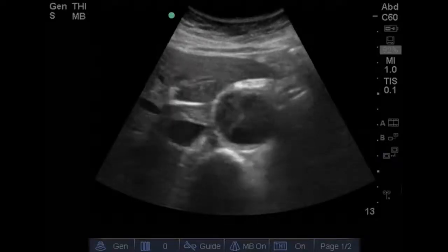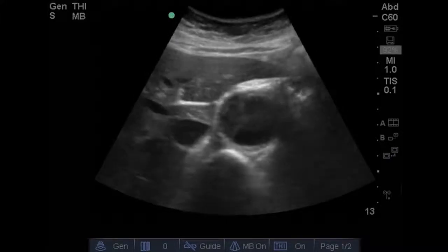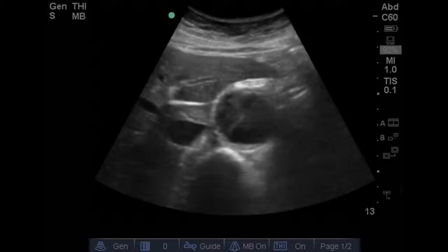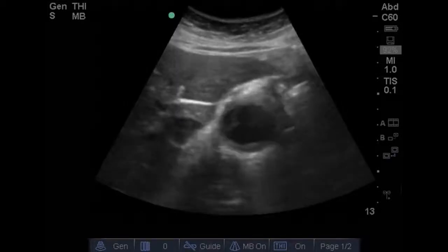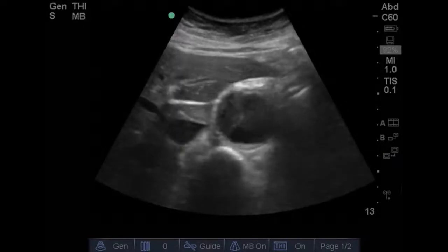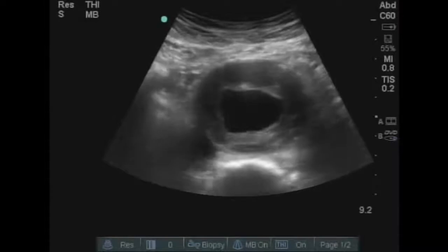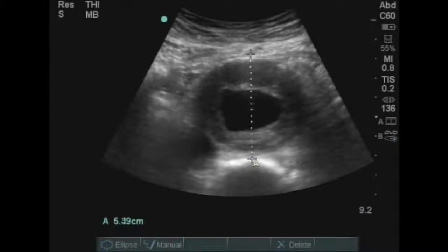Most abdominal aortic aneurysms do have some disruption of laminar flow. And where blood flow is less than ideal, some of that blood will tend to thrombose, and you'll get mural thrombus forming along the aneurysm. And this can be a normal finding within the pathology of the aneurysm. You can see here another example of mural thrombus. And you can have the lumen, which is why we want to measure outer wall to include the entire aorta and not just the true lumen, excluding the mural thrombus.